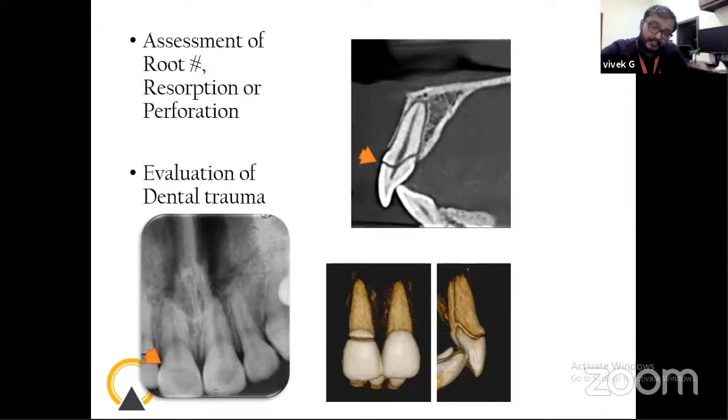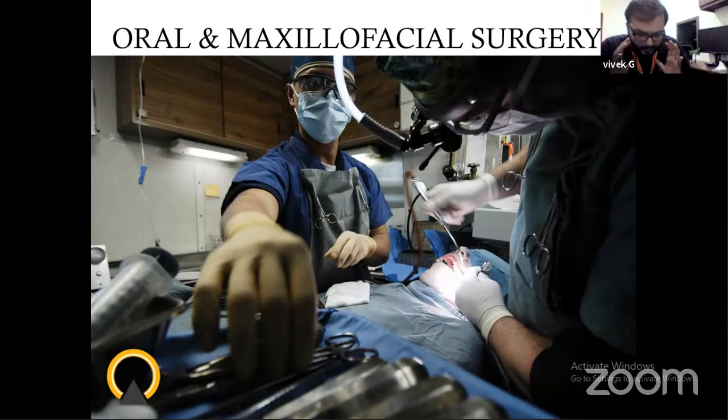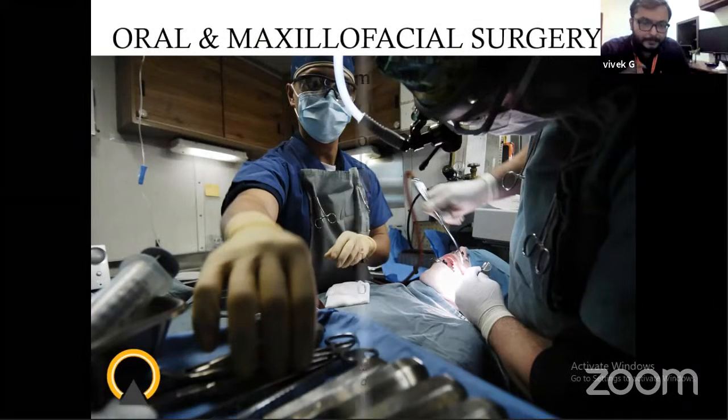But here you can see in the cross-sectional images that the fracture is actually going off at an angle and involving the cervical third of the root as well. So these are examples of cases wherein CBCT can be applied for endodontics. Now, we need to go on to oral and maxillofacial surgical applications of CBCT. I'll just rush briefly through it.